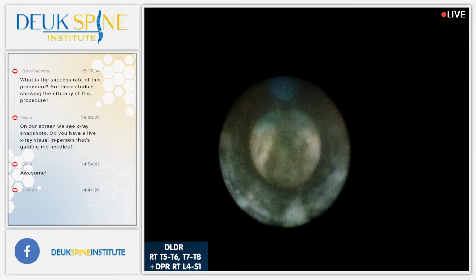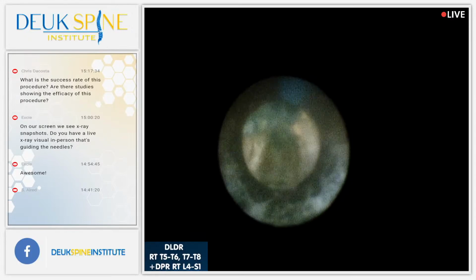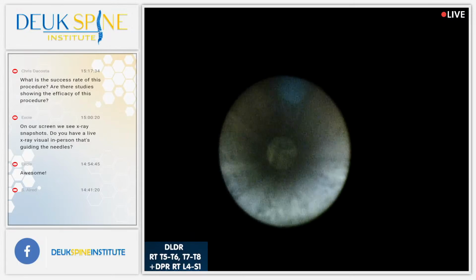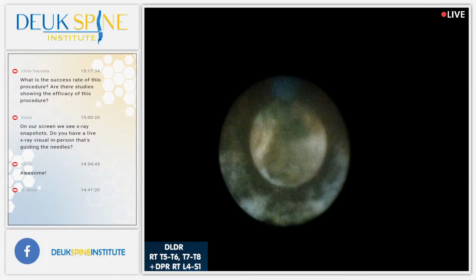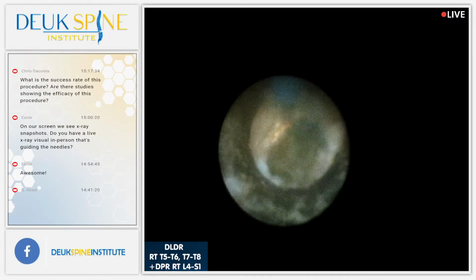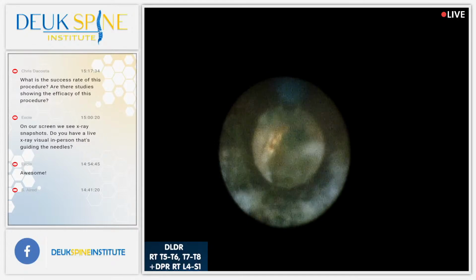As you can see, the blue stuff, I've gotten rid of most of it. I've cleaned out this tear. Just for reference, folks, so you understand what we're dealing with, that glass fiber there at 12 o'clock is 0.5 millimeters, half a millimeter wide. And that's a bone spur right there, by the way, I'm working on right now. You see that? The laser can blast away bone spurs, no problem.